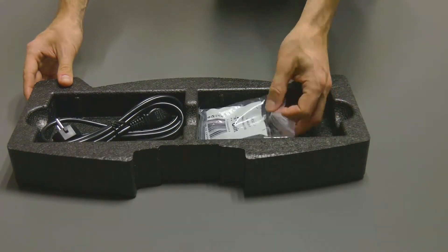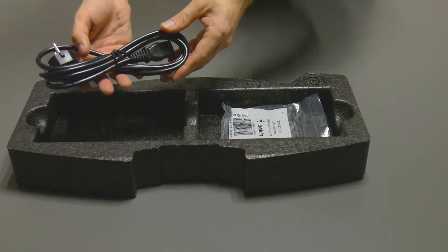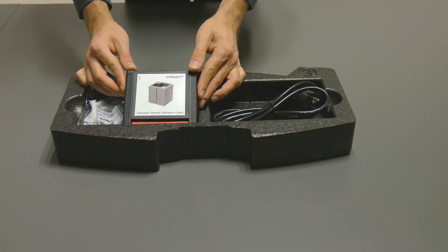The middle insert contains a USB cable and a power cable. There may also be additional accessories ordered by the client or included in the scanner set — for example, an articulated calibration object for the E3 scanner.